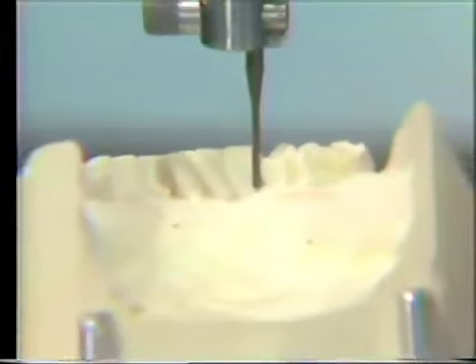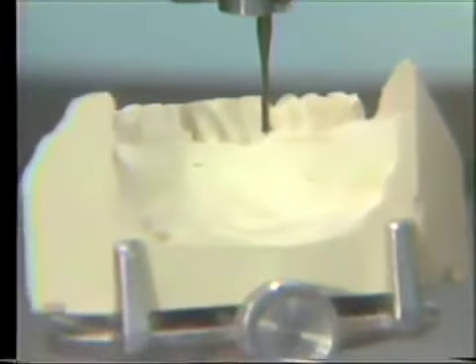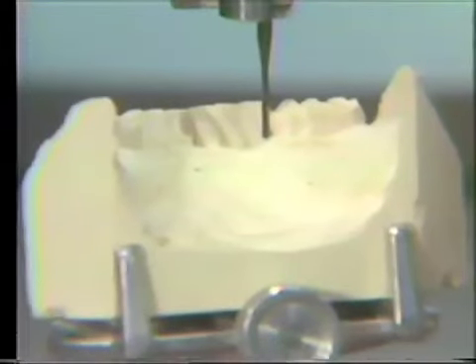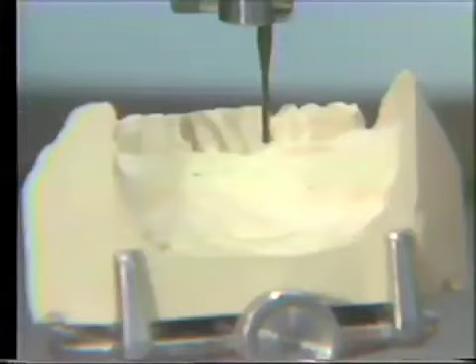Now those are the three areas of the partial that will be contacting the teeth. The two potential abutment teeth and the tooth that I have picked for the indirect retainer on this lower class 2 partial denture.